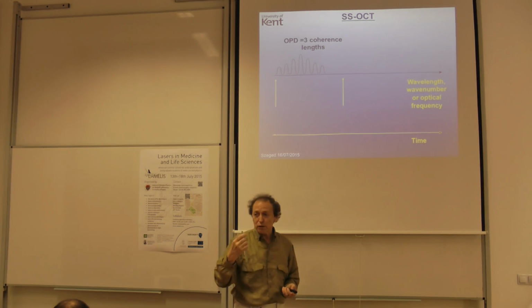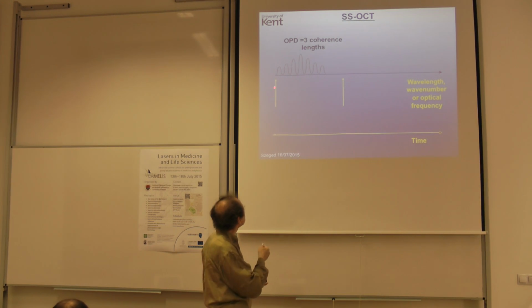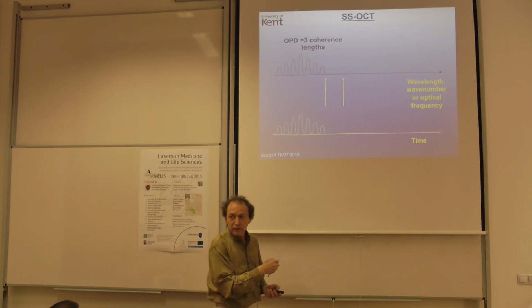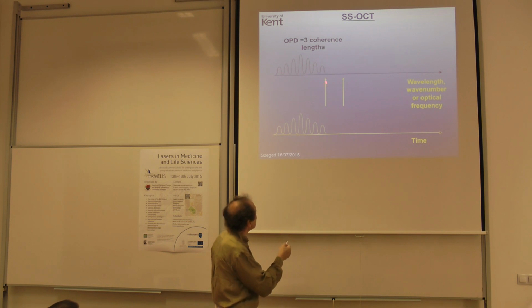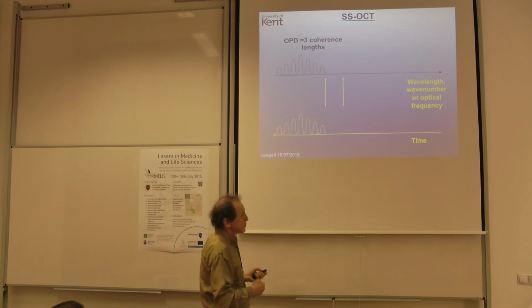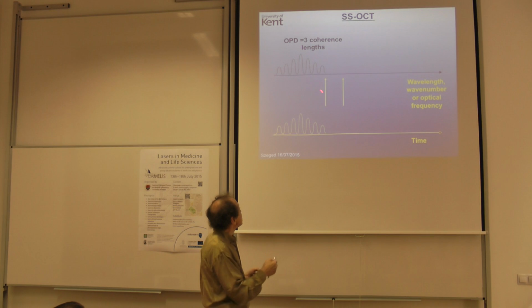If you take now a very thin laser in wavelengths, this is exactly how thin it is in spectrum, and you shift it along, in time, you generate a signal. So you can read it. You read it by practically scrolling the spectrum with a very thin, narrow band laser. So that's the way we interrogate the spectrum. That's the way we read the modulation in the spectrum.